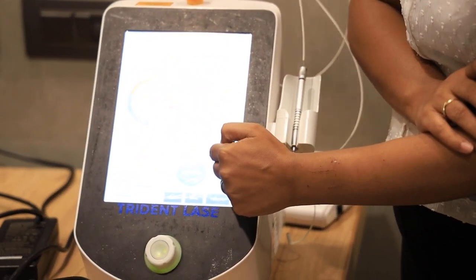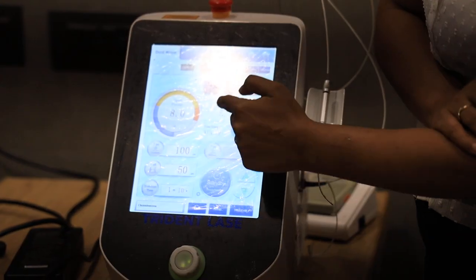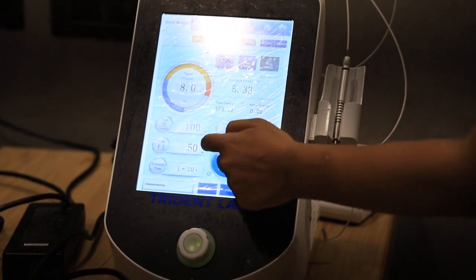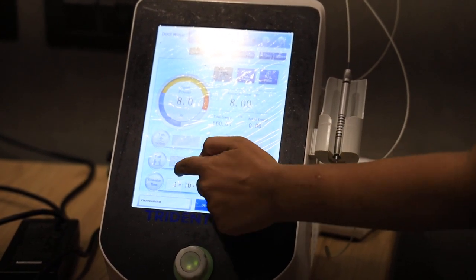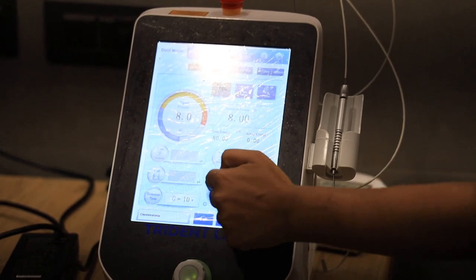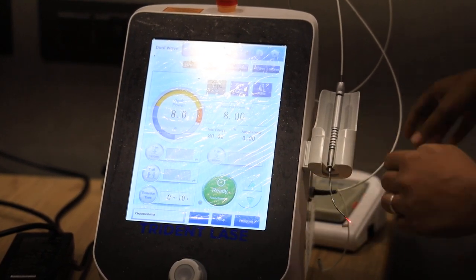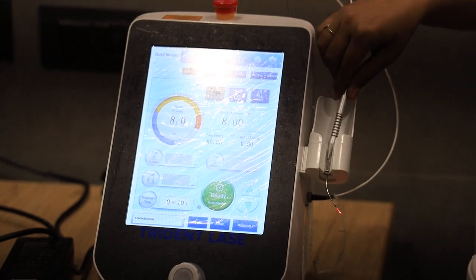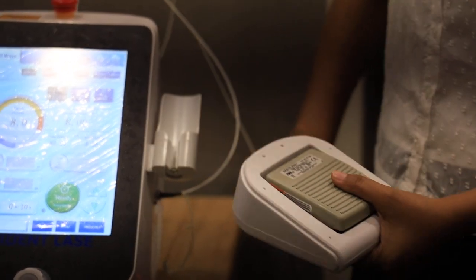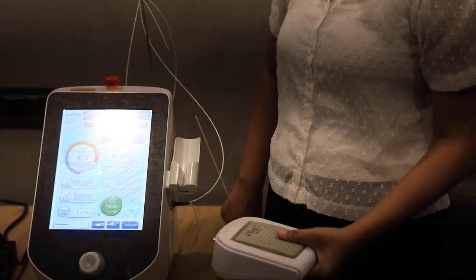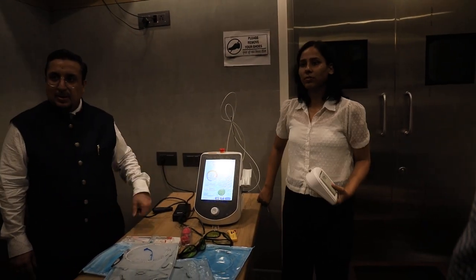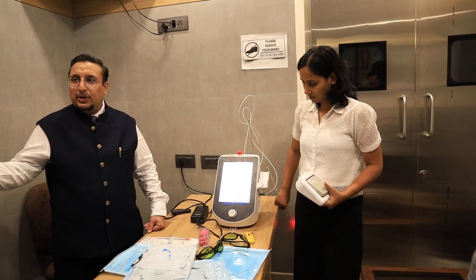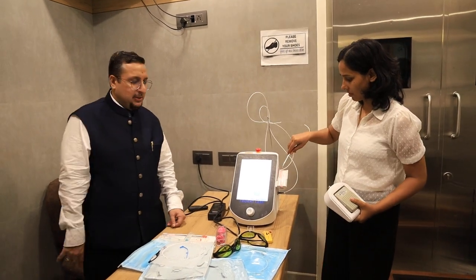Sir is telling you that you have to ask your assistant how much energy is being delivered. So you go to the continuous mode and suppose that we want to deliver 80 joules. You are looking at the patient, so your assistant has to see this actual energy. Somebody has to stand there and tell you how much energy has been delivered.